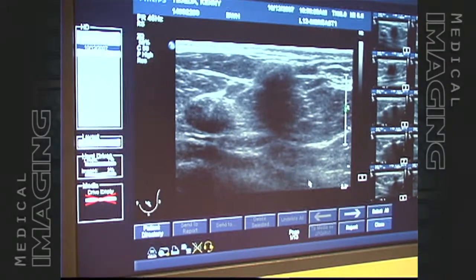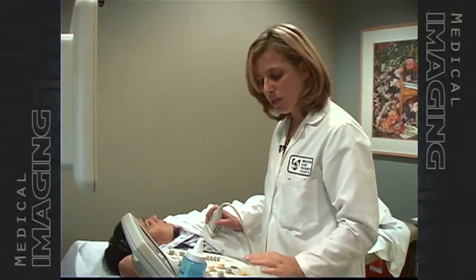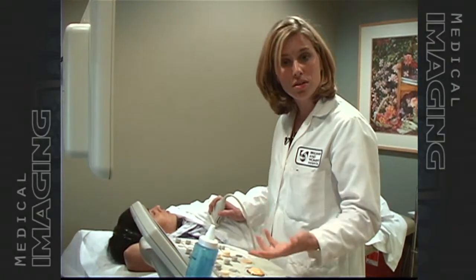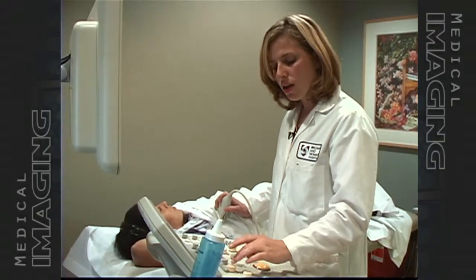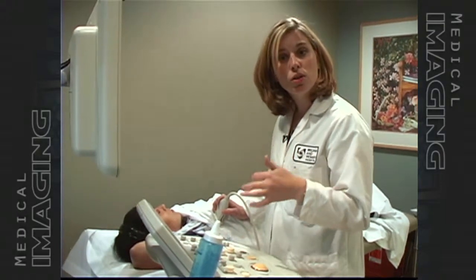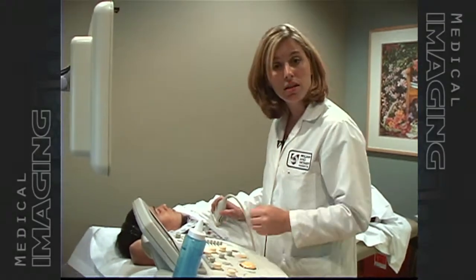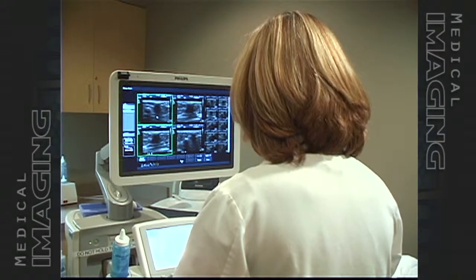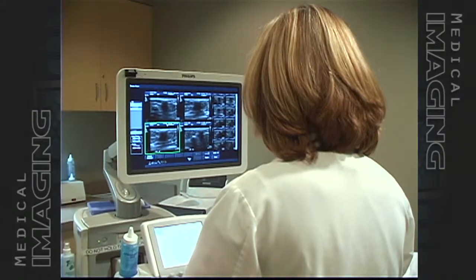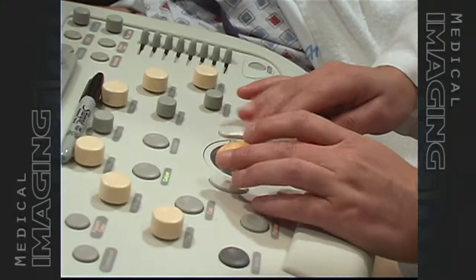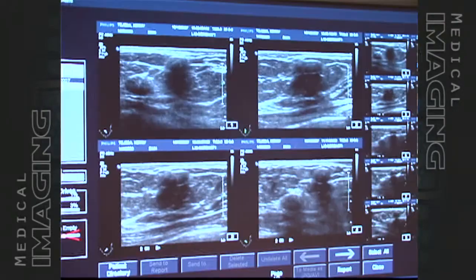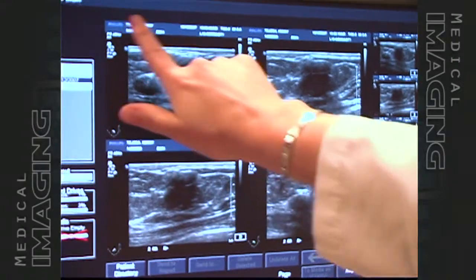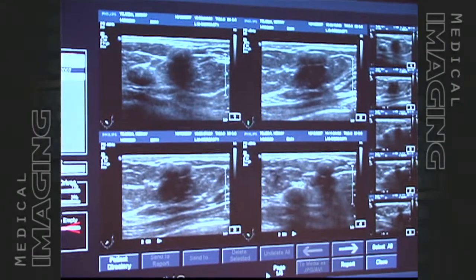In this patient, we can see a mass. When we see a mass, we want to take pictures and document whether it's solid or cystic. We always want to get color flow to see if there's any internal vascular flow, which would indicate a solid mass. We always want to get measurements of the mass in multiple dimensions, and we also want to accurately document exactly where the mass is so it can be found when the patient comes back for another visit — possibly for a biopsy, also under ultrasound guidance.